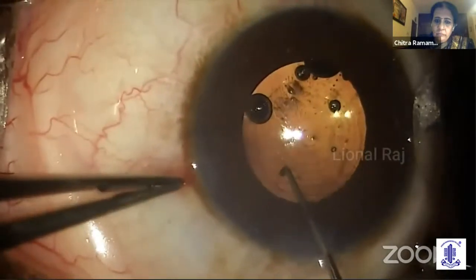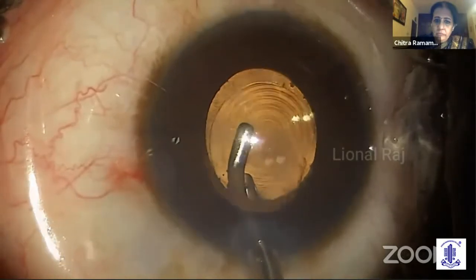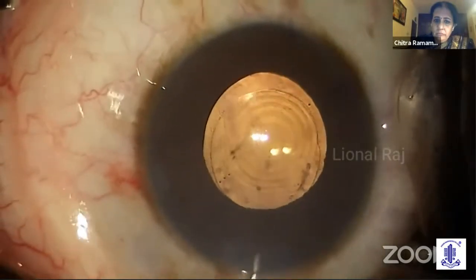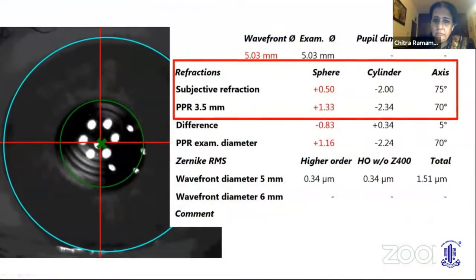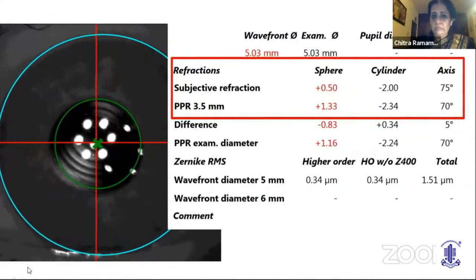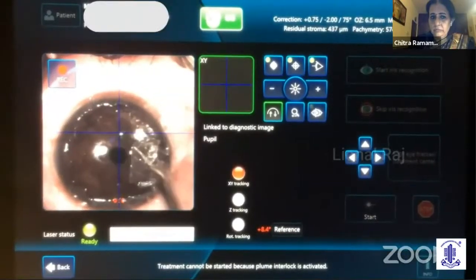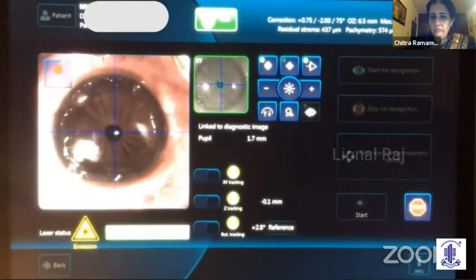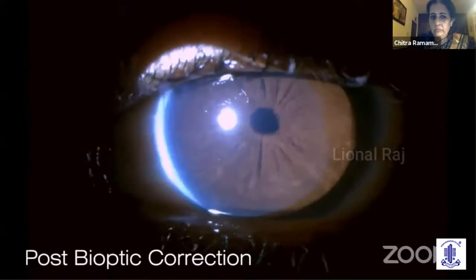Following which, the viscoelastics were removed and wounds were secured well. On post-operative day 1 and after 2 months, the residual was less than a diopter of sphere and 2 diopters of cylinder as predicted. By 2 months, a surface excimer ablation helped in achieving 20/30 N6 vision with no residual refractive errors, and the patient was happy.